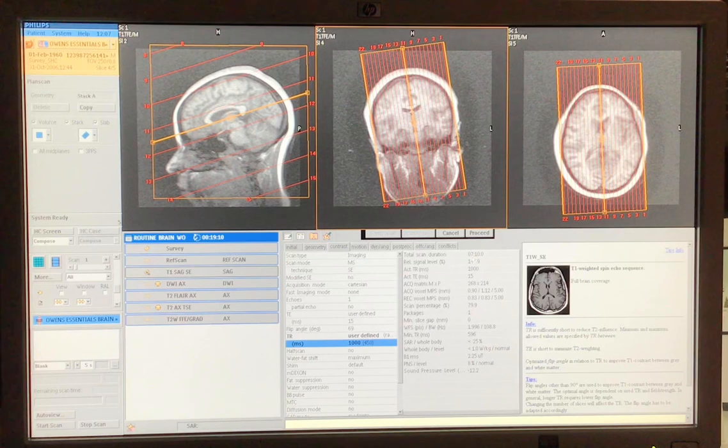And then, during the practical, when we're changing the TE and the TR, as long as we have it in somewhat of that range, that would be okay? Correct, yep. Because that's what I want you to understand from the get-go, just what ranges we should use.